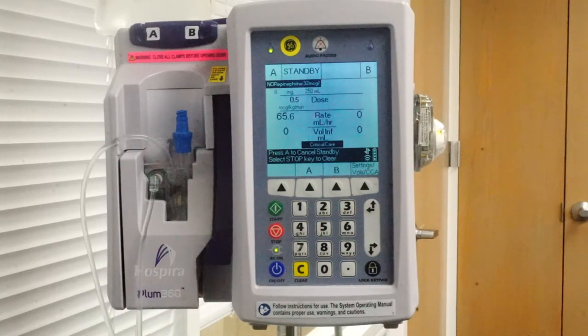So what's essentially happened is it's gone from going at 65.6 mLs an hour to 1 mL an hour. Now, being Levofed, this is a medication to support blood pressure. So you can only imagine what would probably happen. My patient's blood pressure would definitely start to drop. If my patient was super sensitive, this could be a really dangerous situation. So what we can do to prevent any acute event from happening is change the post-infusion rate.